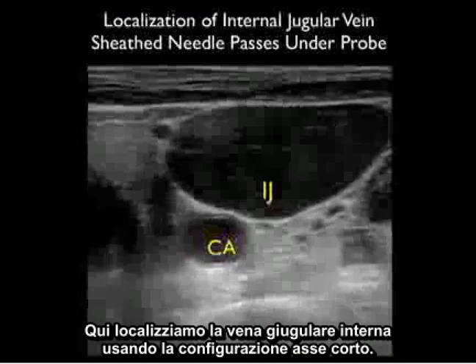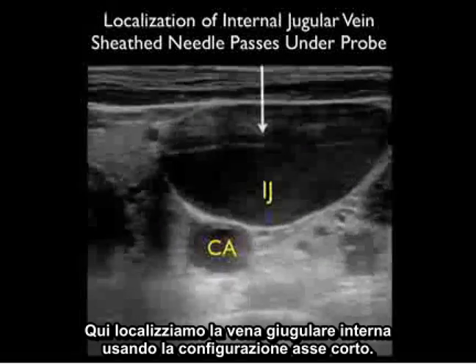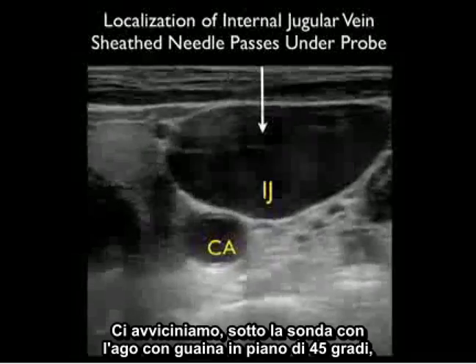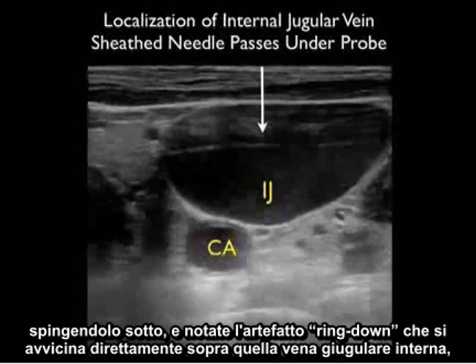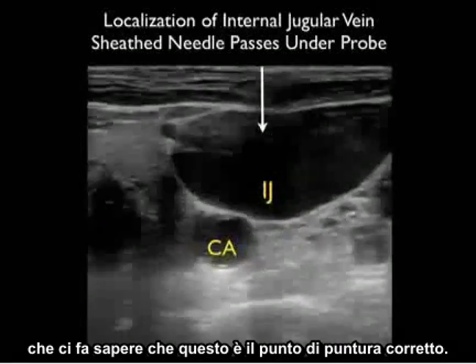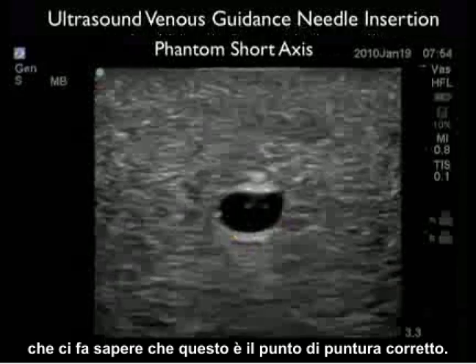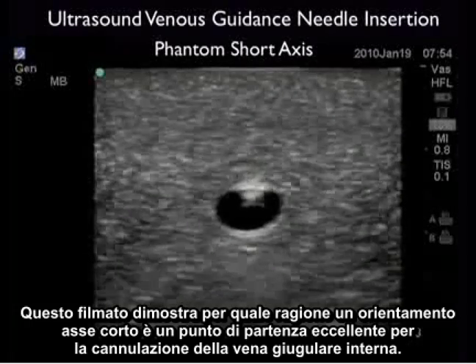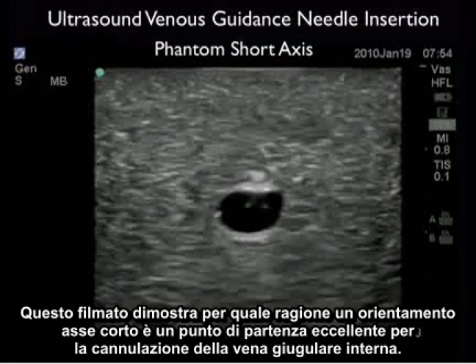Here we're localizing the internal jugular vein using this short axis configuration. We're coming in underneath the probe with the sheath needle at that 45-degree plane, pushing in underneath, and notice the ring-down artifact coming in directly on top of that internal jugular vein, telling us this is the correct puncture point. This video clip shows why a short axis orientation is an excellent starting point for cannulation of an internal jugular vein.